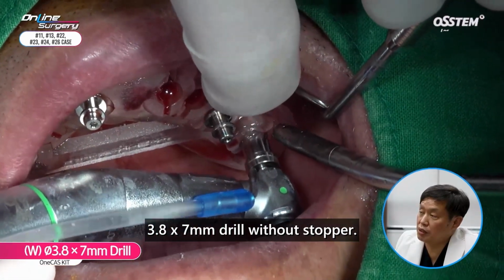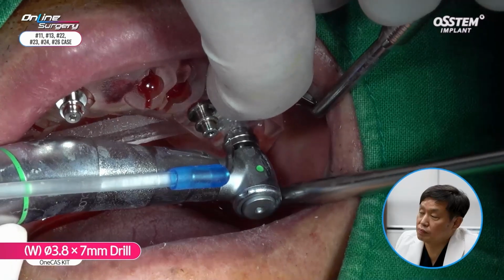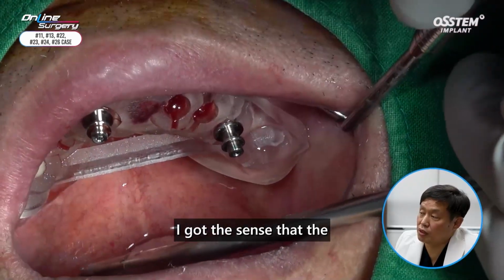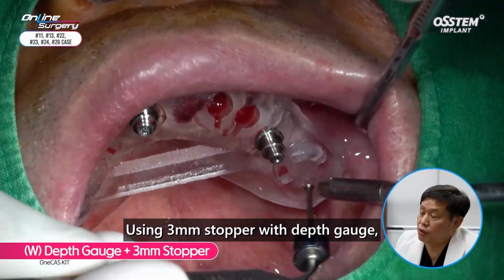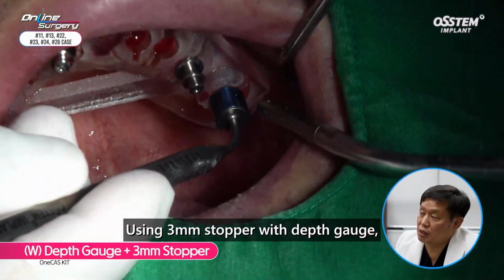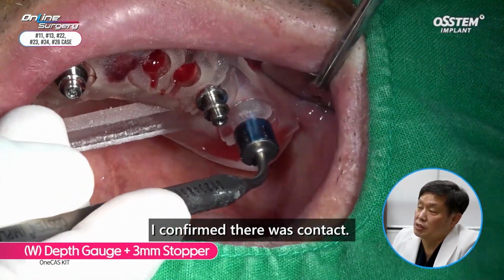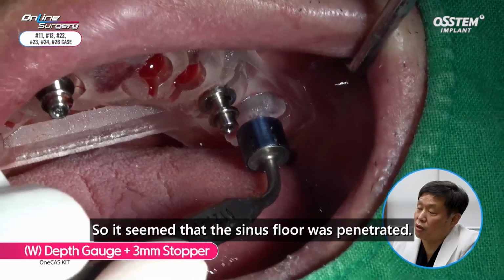3.8 by 7 millimeter drill without stopper. I got the sense that the sinus floor was penetrated. Using 3 millimeter stopper with depth gauge, I confirmed there was contact, so it seemed that the sinus floor was penetrated.